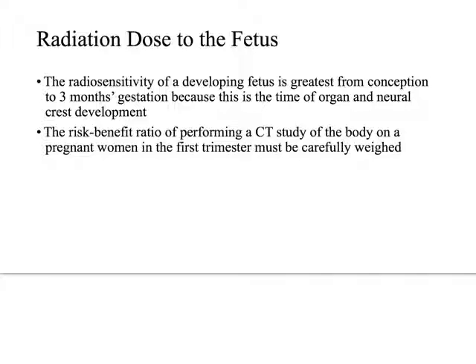Because as a CT tech, I got very accustomed to saying, hi, my name is Ben, I'm a CT tech, I've been working here for about 10 years or whatever. Is there any chance you could be pregnant? When was your last menstrual period? This is how I meet women all the time, right? You get pretty immune to asking people these kinds of questions. They kind of expect to be asked this kind of question. Why am I asking them about their last menstrual period? It's because of point 1 here.